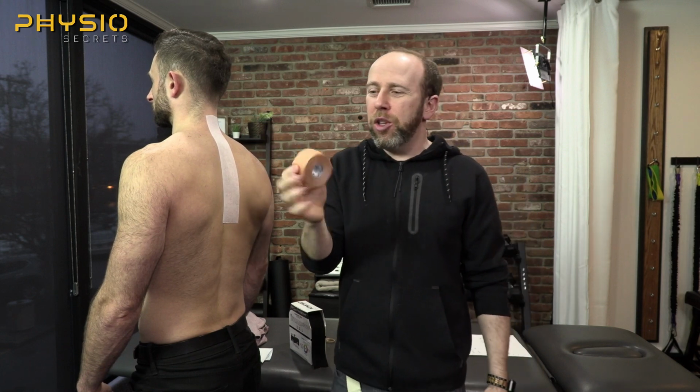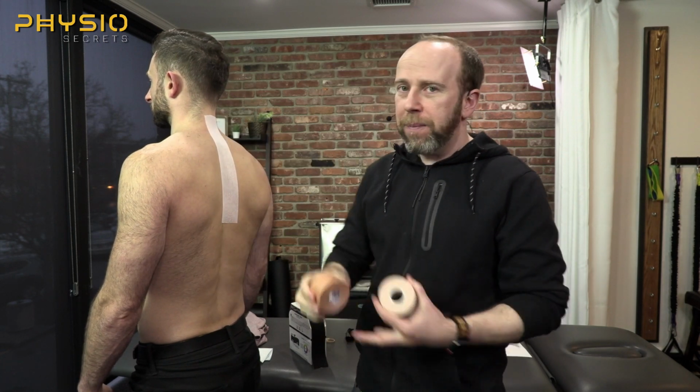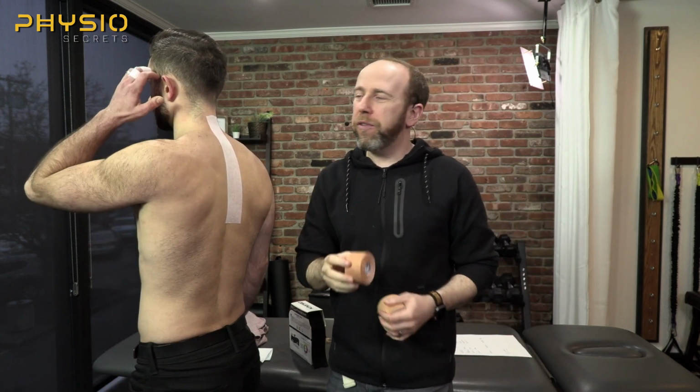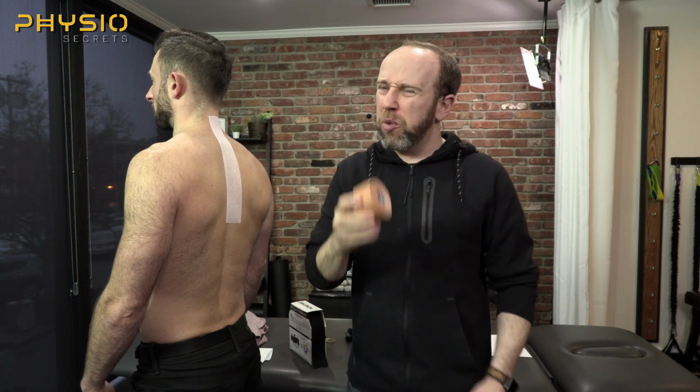So it's essentially Leuko tape and this tape work hand in hand, but whatever you do with the posture tape, you can apply Leuko to stiffen it up. But bear in mind, when you apply Leuko tape, it's not breathable, so you're going to get water trapped underneath the tape when they take a shower. This tape tends to get really gooky when you shower with it, and then the person wants to take it off or it'll fall off. So, this will last about 3 to 5 days as well, but the tape starts to look really nasty.